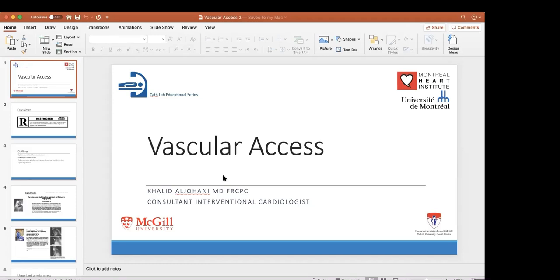لا you have to give local anesthesia. وانا الصراحه اللي كنت استخدمه في كندا كنت استخدم الهايبوديرمال نيدل حقت الانسولين. I inject with it حتى المريض ما يحس بالنيدل. لكن give them a local, it's very painful. next time ممكن I work with you I'm gonna يعني ادخل radial puncture في your hand without anesthesia and tell me how you feel. It's painful, so you have to give.